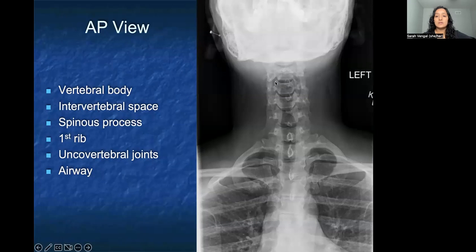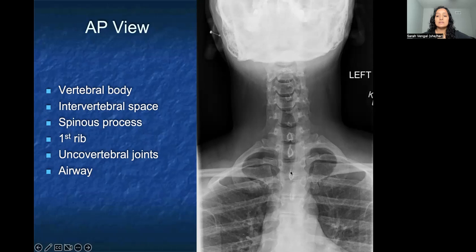On the AP view, I first look at each vertebral body to make sure they are relatively equal in height and symmetry. I also look at the intervertebral space to see if that is relatively maintained throughout. To help assess alignment, I look at the increased sclerotic areas in the center of each vertebral body, which is actually the spinous process viewed on end. It's also helpful to look at where that first rib is — it's supposed to come off the first thoracic vertebral body, but occasionally a patient has one off a cervical body, which can cause some impingement in the thoracic outlet.